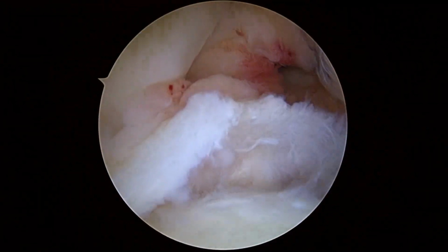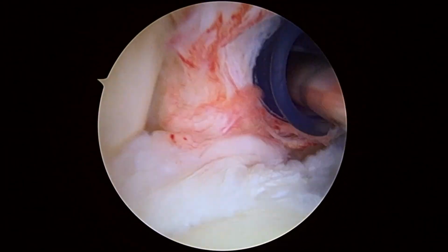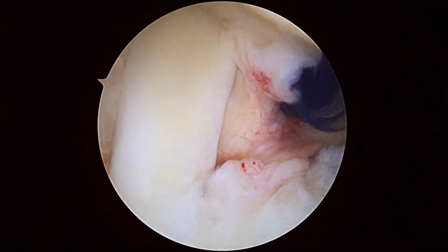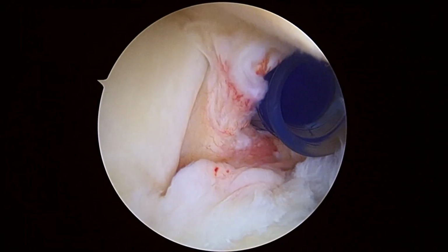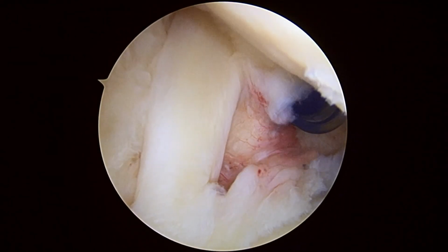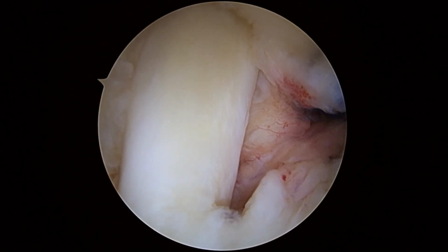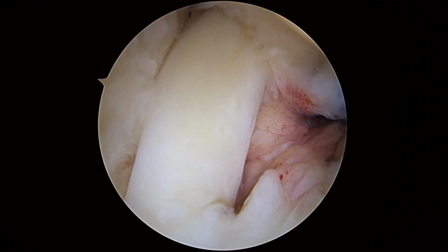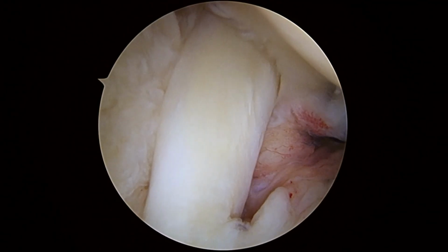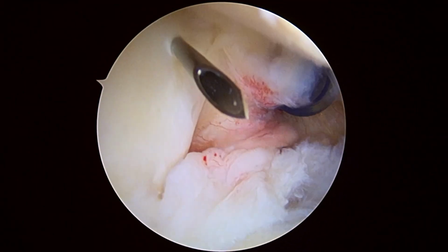Okay, so the next step is to go ahead and take a spinal needle, and we're going to pass that through the torn biceps here. That was pretty good, but I want to do a little bit better though. That looks pretty good there. That's right down the middle. We'll go ahead and pass a relay through that.